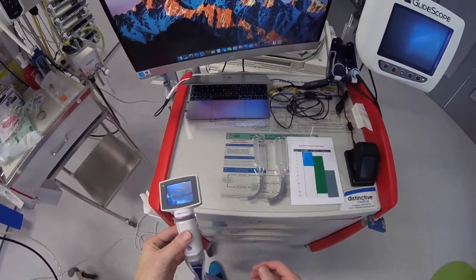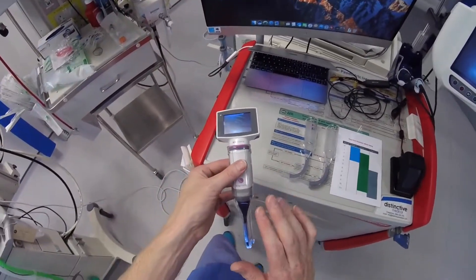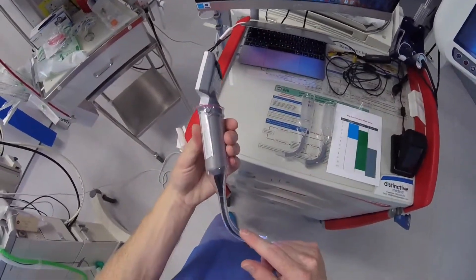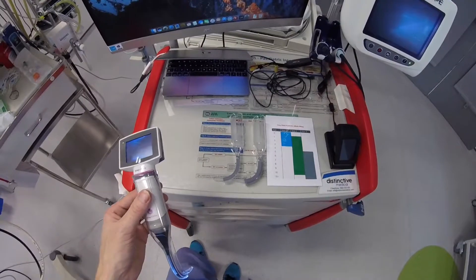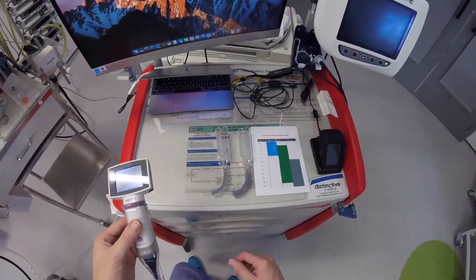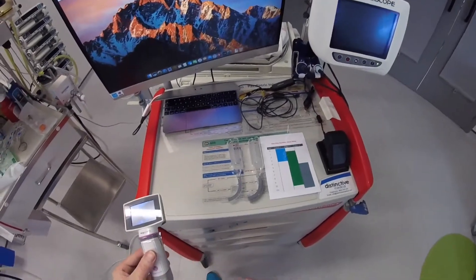The A-Blades come in two different sizes to use with the Paediatric video monitor. You've got a size 1, which this one is, and that's for children less than 3 years of age. They also have a size 2 blade, which is for children between 1 and 10 years of age.